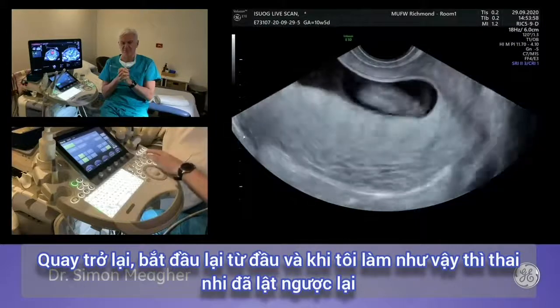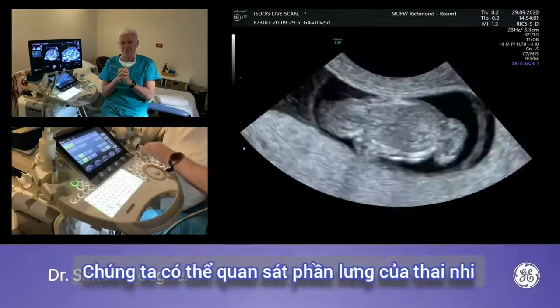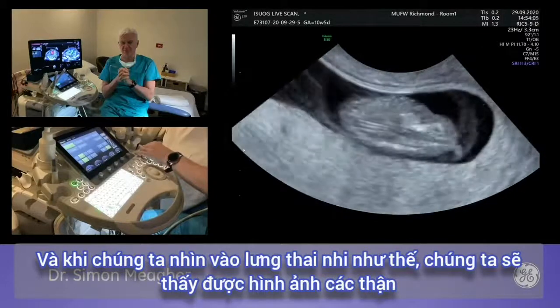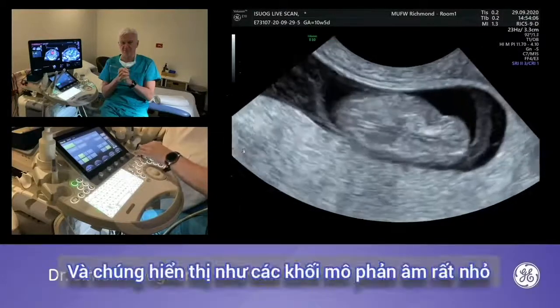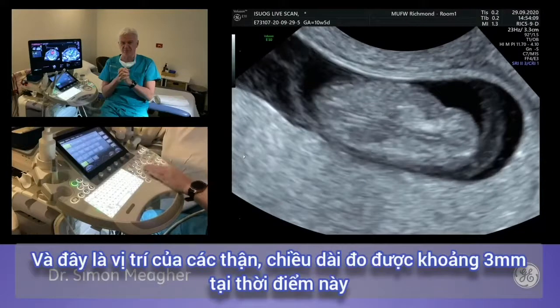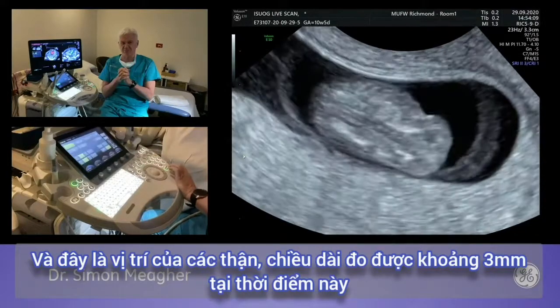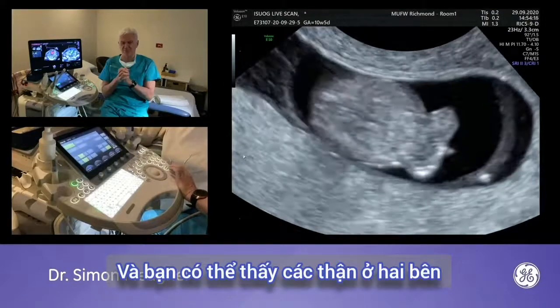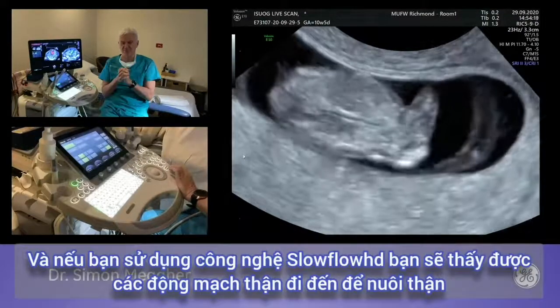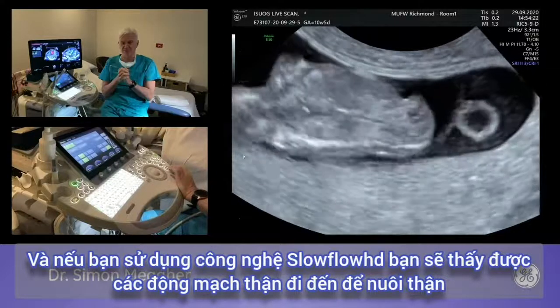Starting over with the fetus now turned, we look through the fetal back. Looking through the fetal back, we can see the fetal kidneys — a tiny echogenic clump of tissue measuring around 3 millimeters in length. You can see the kidneys on both sides. Using slow-flow technology, you can actually identify the renal arteries supplying the kidneys.